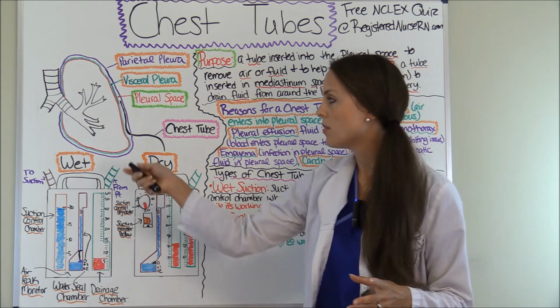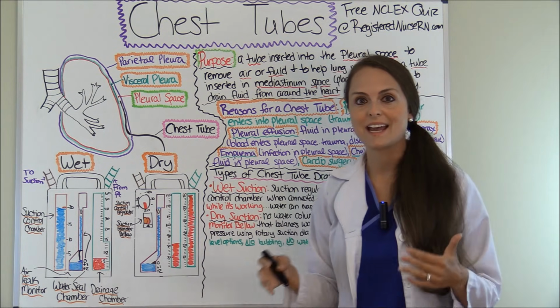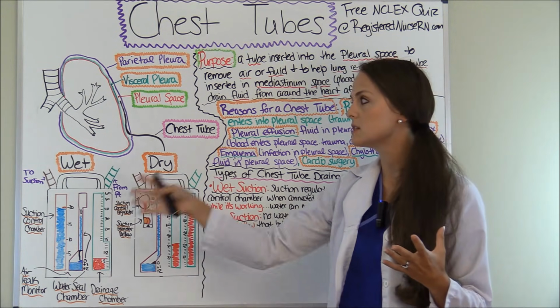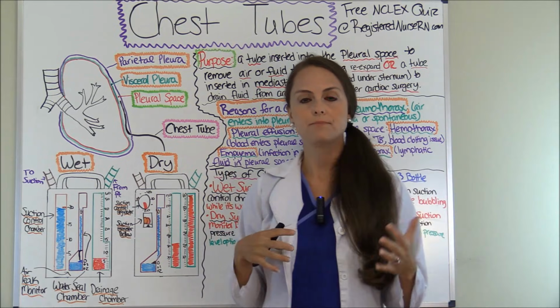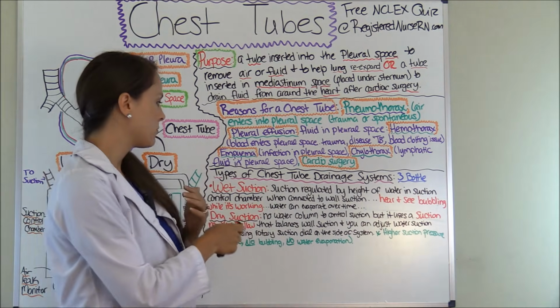Now notice, on the wet suction and the dry suction, it looks a little bit different, and that is the biggest difference with these two systems: how the suction works. So let's cover it. Okay, wet. Let's talk about the wet suction.